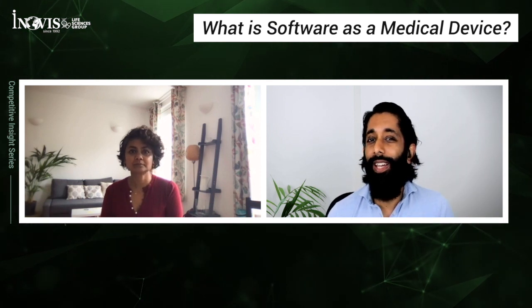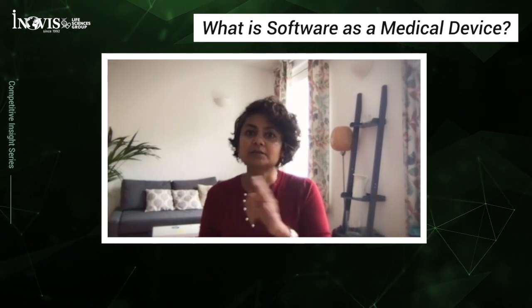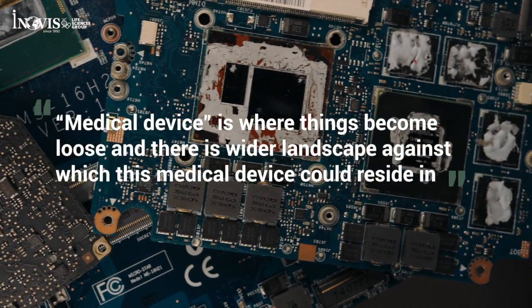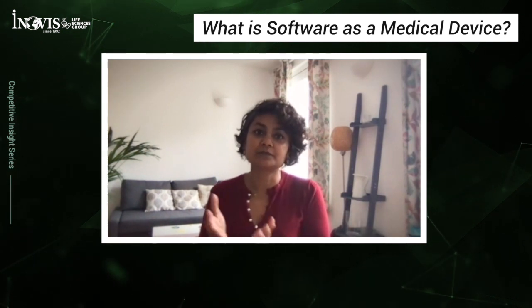Can you tell us what that is in the simplest terms? Yeah, absolutely. If we just look at the words software as a medical device, I think that in itself tells you that it's a software application that is being used as a medical device. While software is still a well circumscribed word, medical device is where things become loose and there is a wider landscape in which this medical device could reside. So software as a medical device could be as simple as a digital thermometer, or it could be as complicated and life critical as a pacemaker with a digital application on top of it. Right. So both of those ends of the spectrum would essentially be SAMD. They would be classified under different classification spaces, based on the risk that they introduce into the existing treatment pathways. But the overall umbrella would still be software as a medical device.